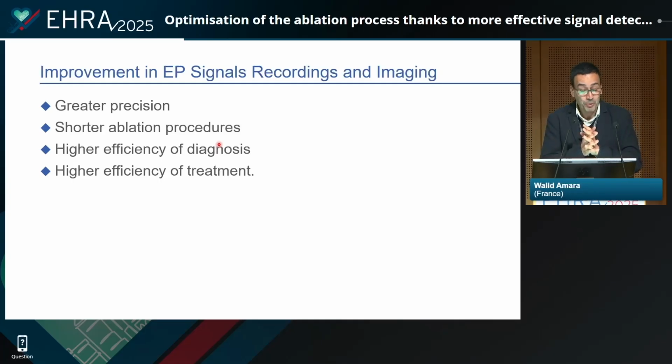I think that improving the quality of the signal is very important because it will help us with greater precision, with shortening the duration of the procedure, and increasing the efficiency in our diagnosis and also in our treatment.